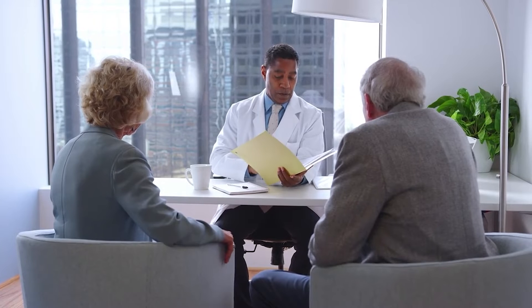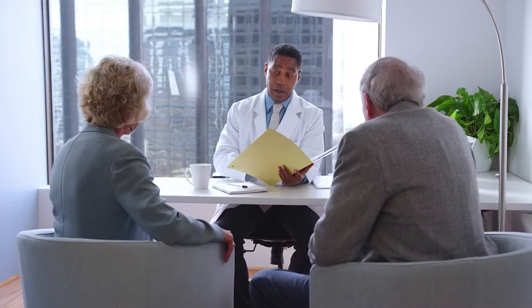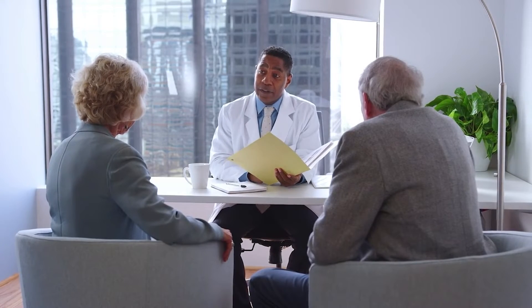If you are determined to be a candidate, you and your caregiver will be provided details about the surgery and any associated risks of LVAD therapy, such as death, bleeding, stroke, and thrombosis, as well as other possible adverse events.